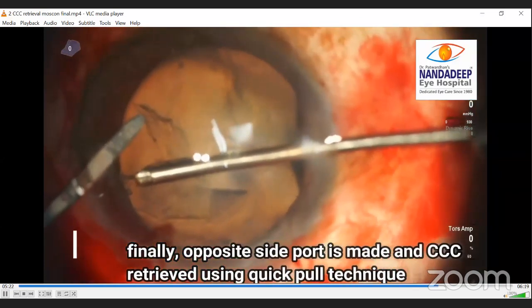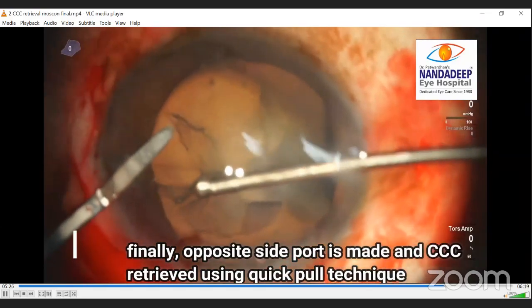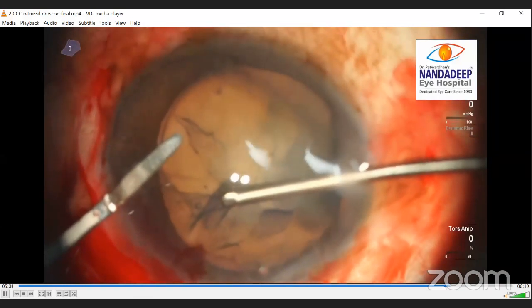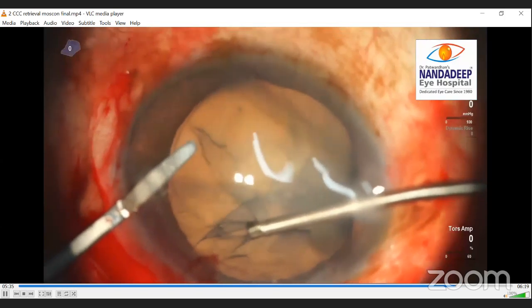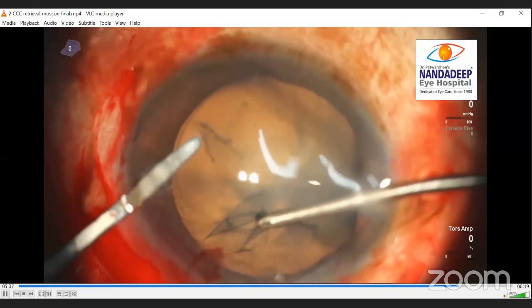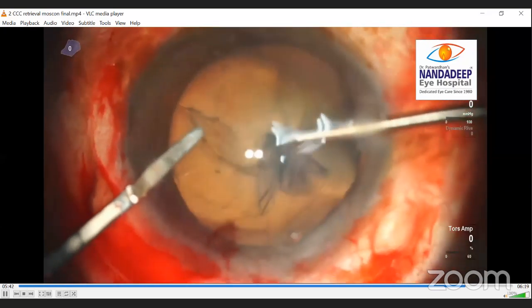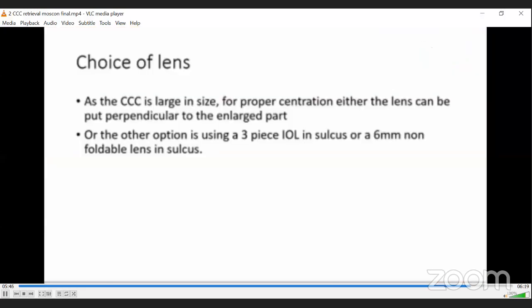You can see here, as I pulled it, the zonules which were holding the rhexis back got broken. And once they were broken, the Capsulorhexis came in and we could complete the Capsulorhexis. So I think this is one of the usual useful techniques. I will show it in some other videos as well.